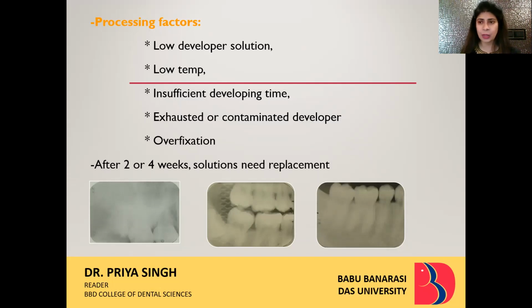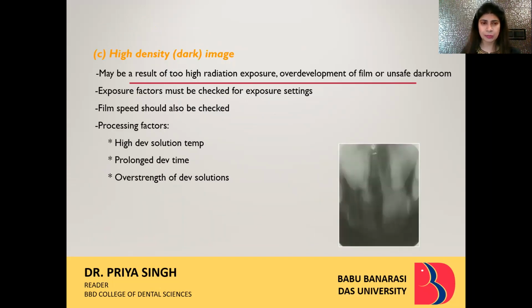It's usually said that whenever the processor is used, whenever replenishment is done, a date should be mentioned over there, so that depending upon the usage, depending upon how many radiographs are taken in a day, it should be checked whether the processing solution has to be replenished after 2 weeks or 4 weeks. Otherwise, the radiograph will require a second exposure.